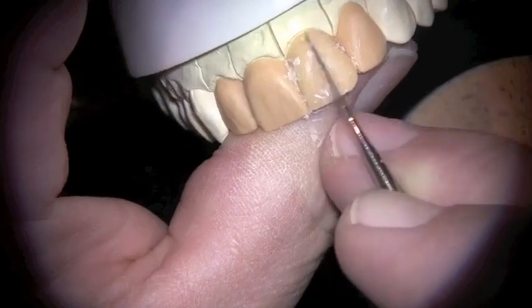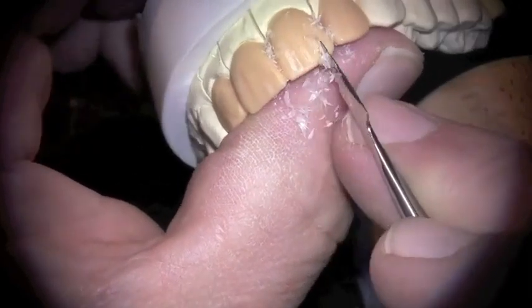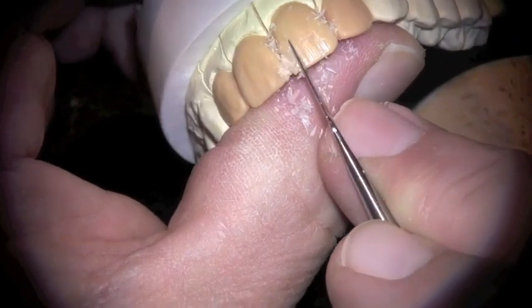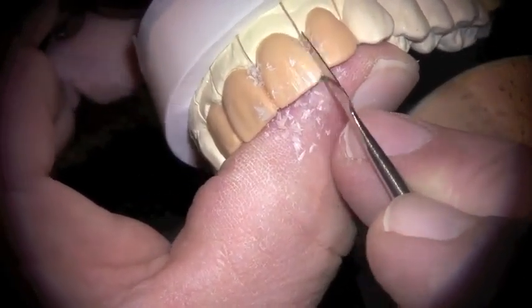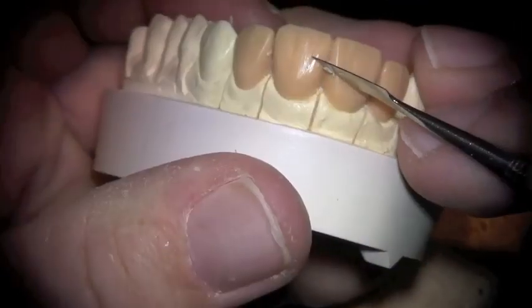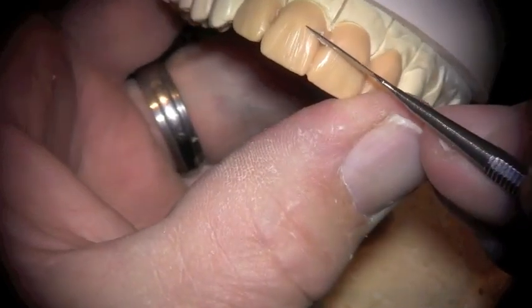Those teeth looked a little bit big to me initially, so I wanted to downsize those just a little bit. Detailed waxing and all of your surface texture is very, very important, especially with a monolithic lithium disilicate restoration. It's much easier to do this in wax than it is grinding on a relatively hard lithium disilicate material.